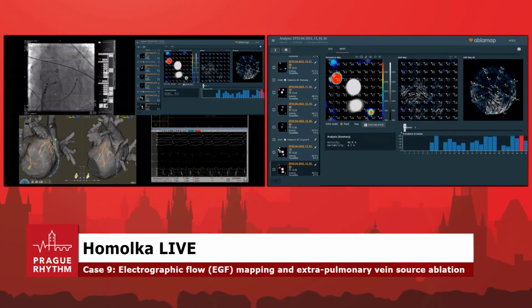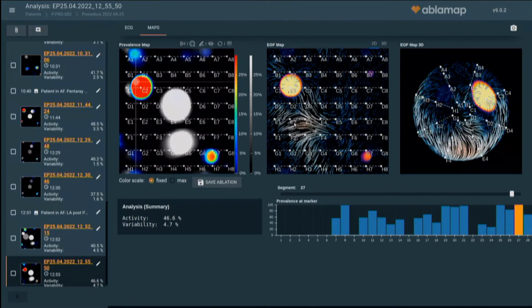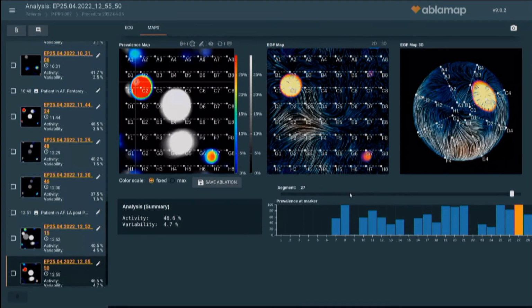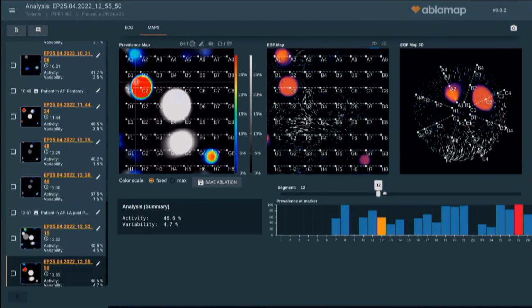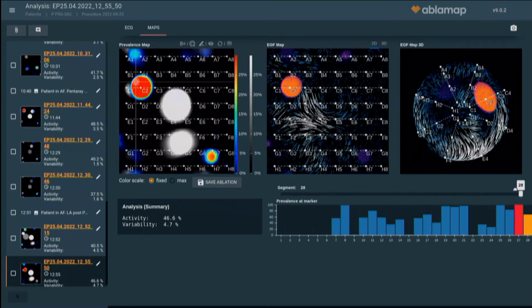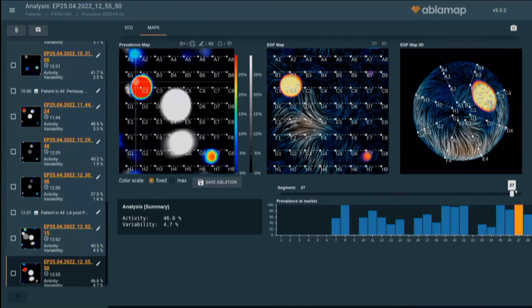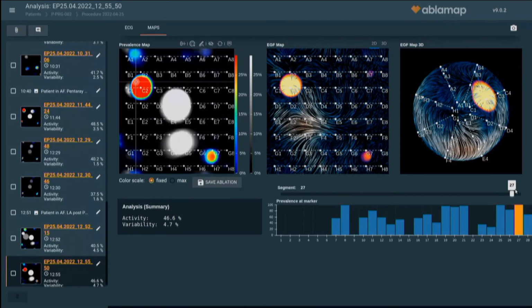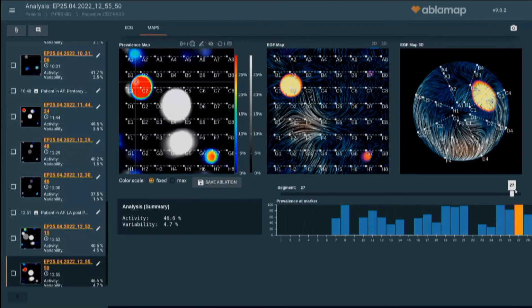So did you guys see that, by the way? If you look here on the EGF map, on the far left, the big red spot is the one that's the most common. And on the bottom, it shows you in each of the 2-second intervals how frequent it is. We're scanning through all of them, across the 35 individual 2-second maps. It's not there 100% of the time, but it's there 46.6% of the time. That we would consider a pretty high source. Anything above 26.5%, we consider a targetable source.